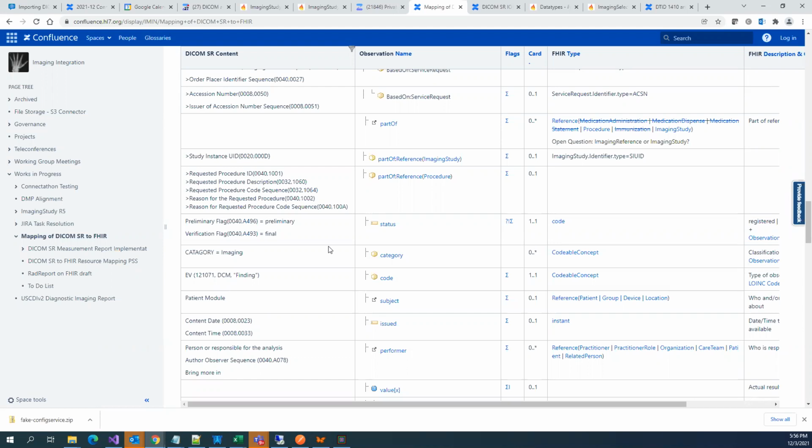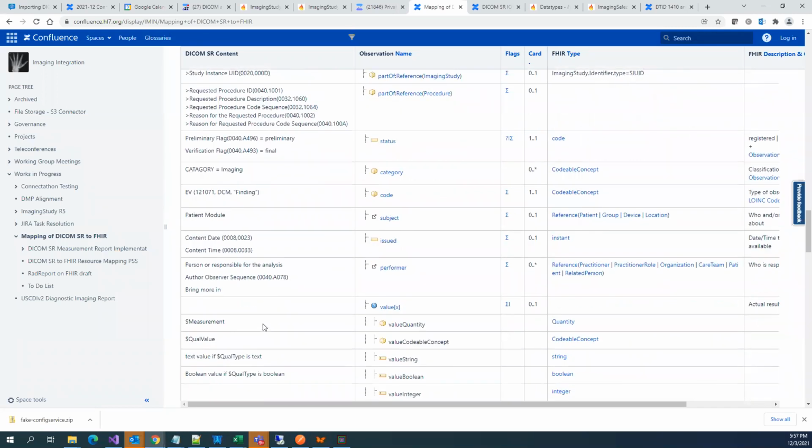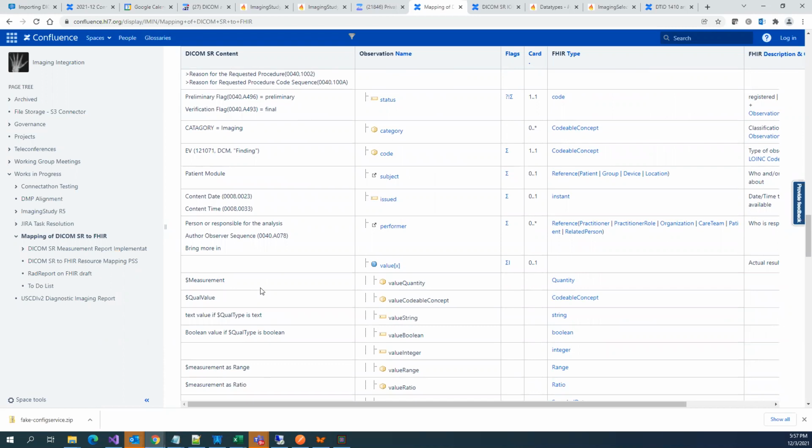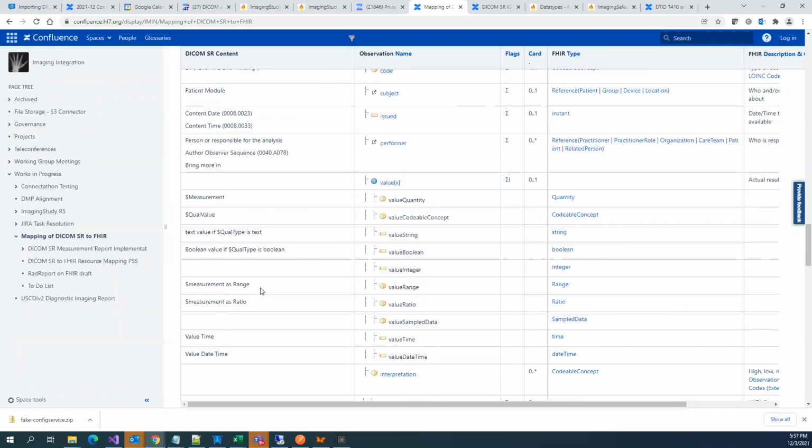Maybe in the coming connectathon we can extend that, but for now, creating observation itself is a big task in my opinion, because these mappings we need to establish. There are so many derivations out of it, which we need to ensure we are taking care of. So we'll be using R4, right? We'll be using R4, yes. Okay.